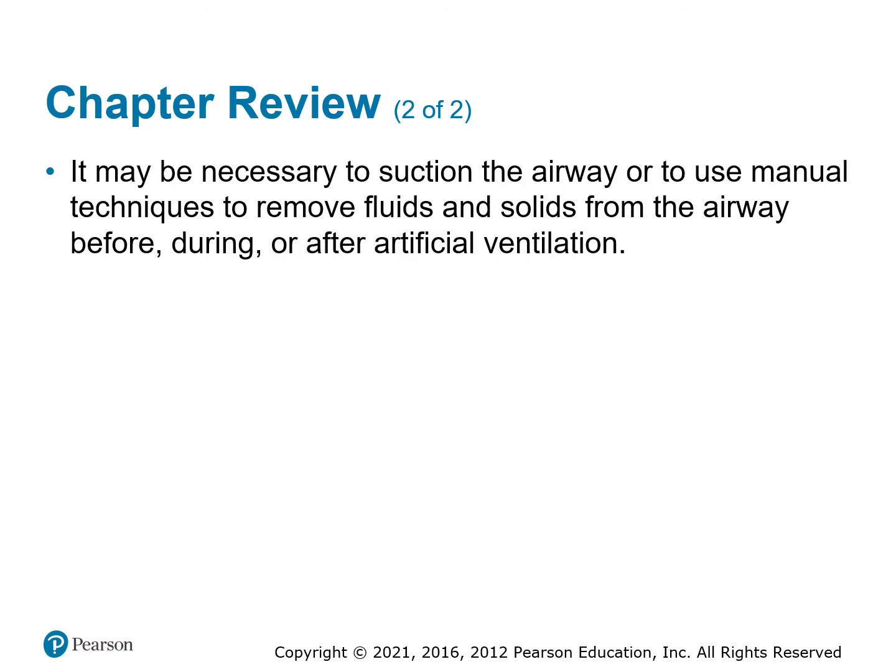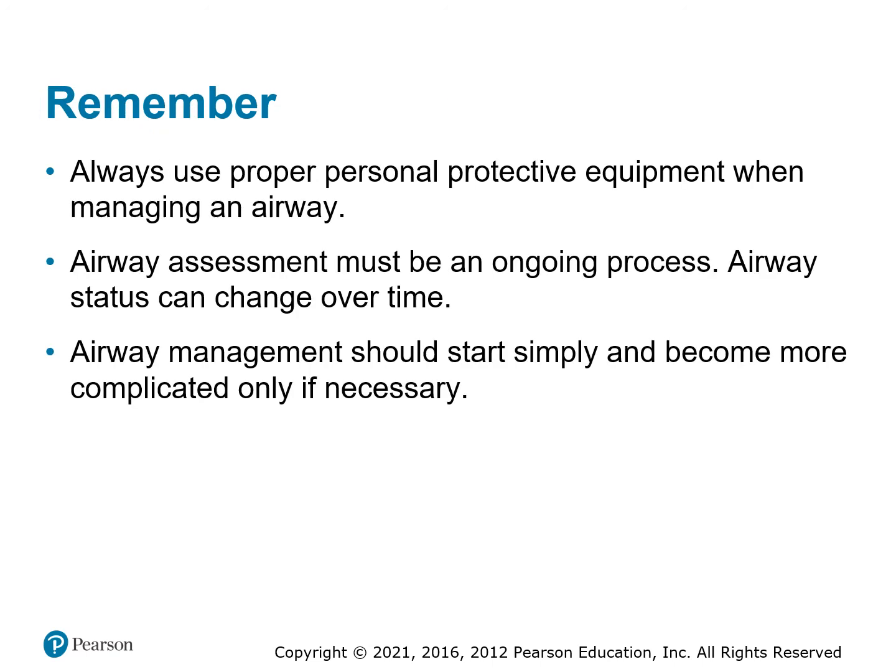You may have to suction throughout the entire call. So be prepared and ready to shift the patient to the side, have suction units ready, and communicate with your team about who's going to do the suctioning, who's going to do the artificial ventilation, and vice versa. Always use proper PPE. Protect yourself from fluids. Airway assessment is before, during, and after. You need to assess the status of the airway throughout the entire call.